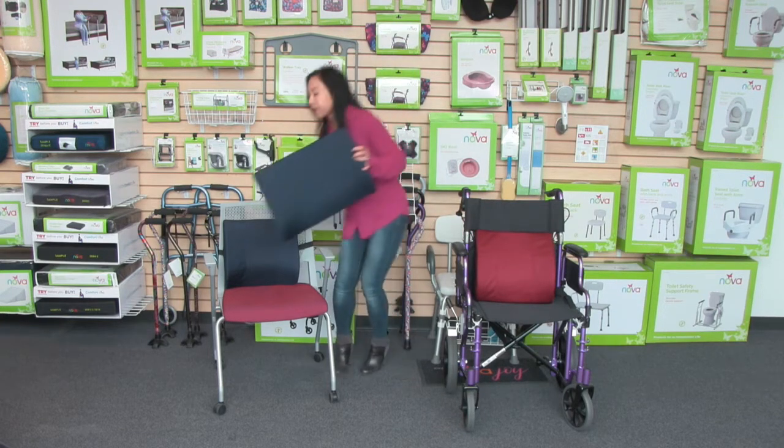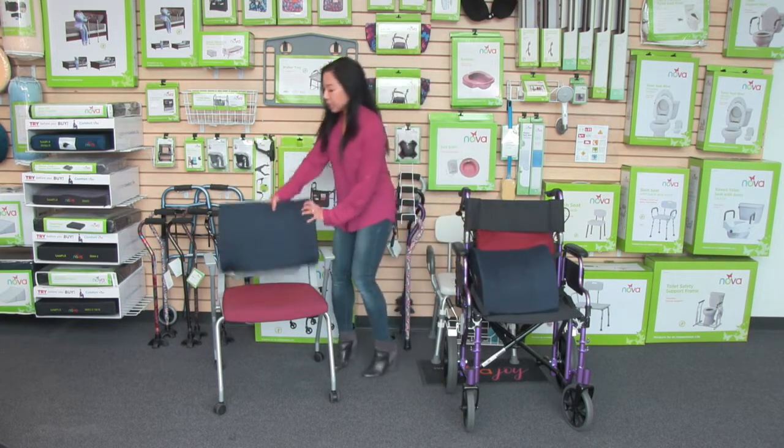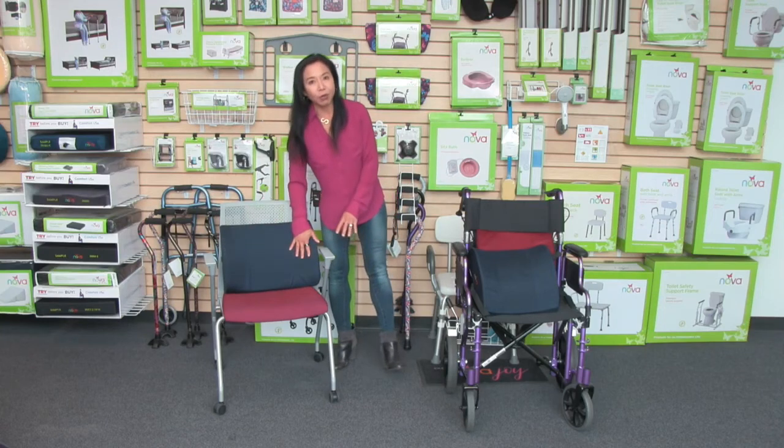We also have an extra wide option that is 17 inches, which is great for someone who needs more width on their lumbar back cushion.